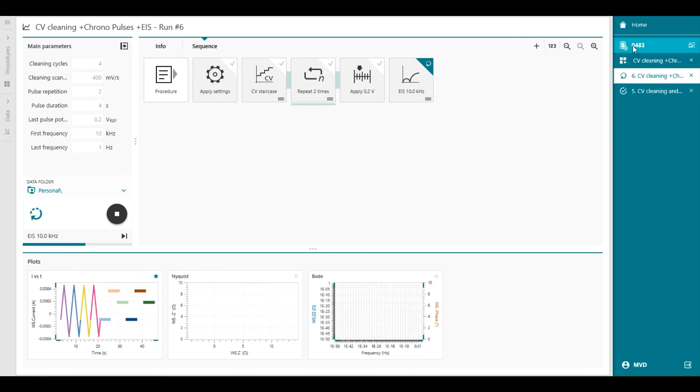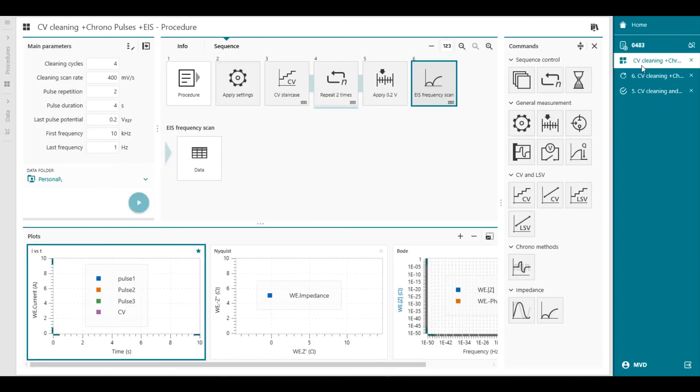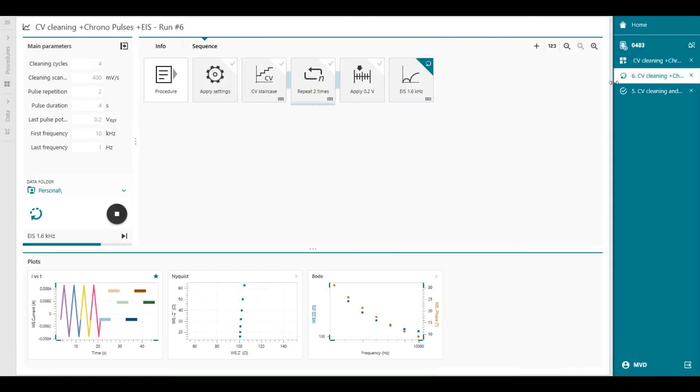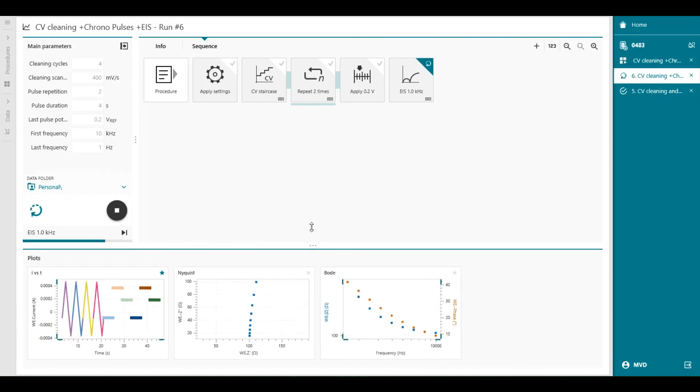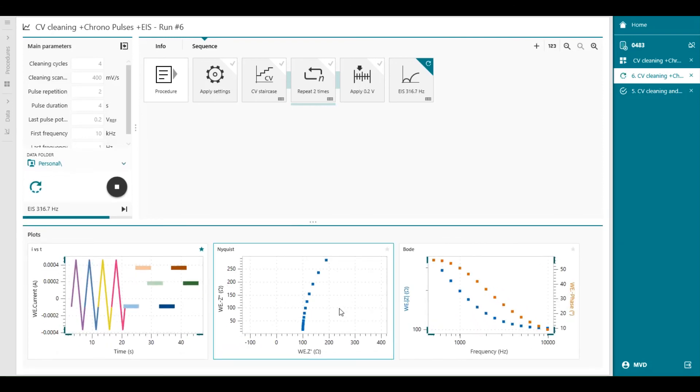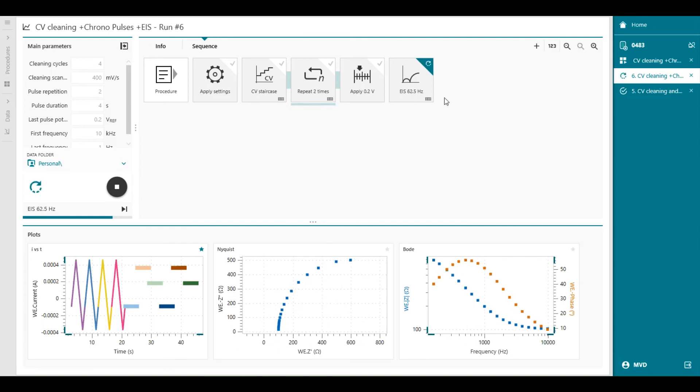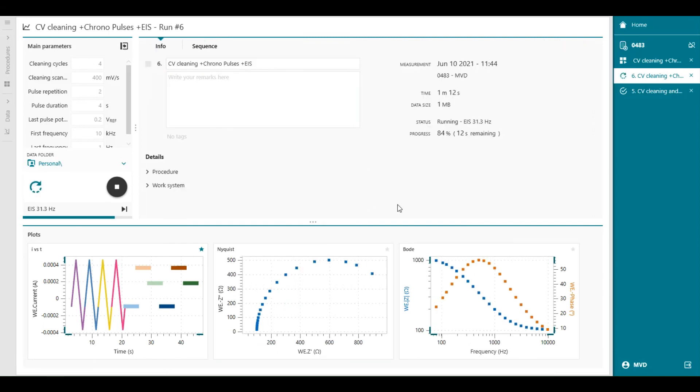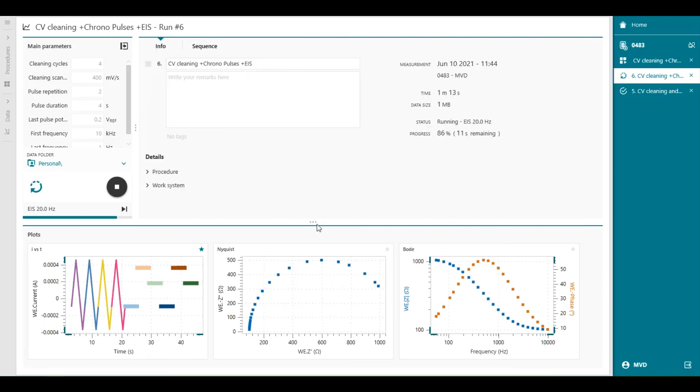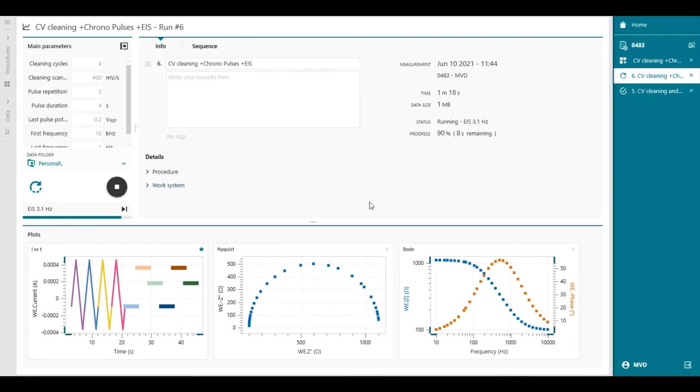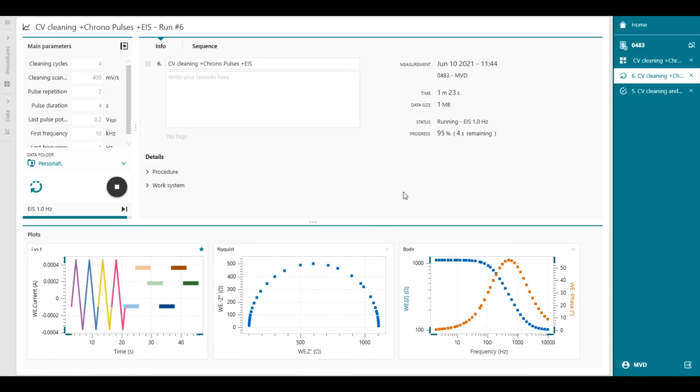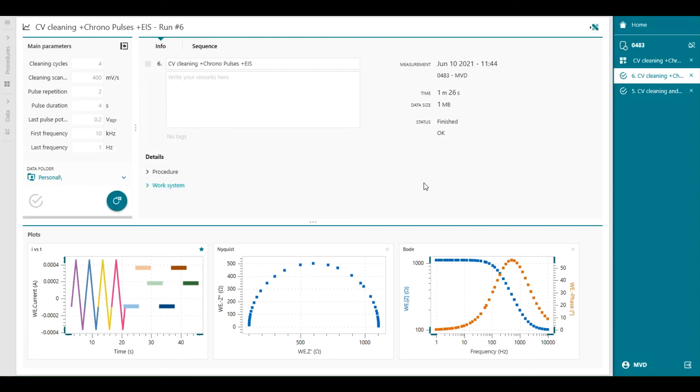We can also watch the menu control window. So you'll see what kind of voltage is supplying, what kind of current is measuring, the power and all the things. We can go back to my plots and here you will see that the impedance measurement is running. And it's almost finished. It goes down to one hertz. Now it's finished, you'll see a check mark of the data.